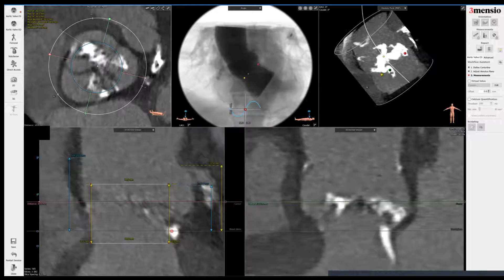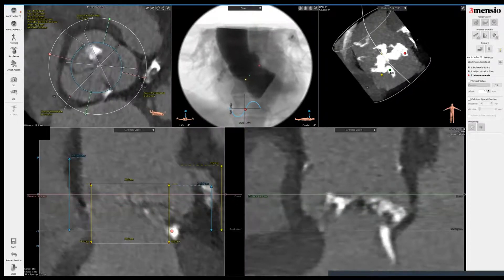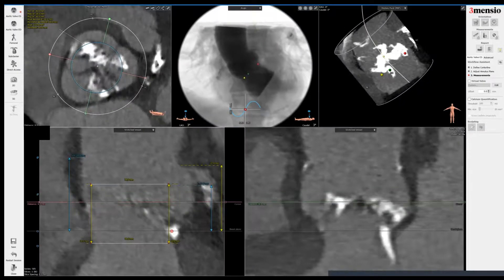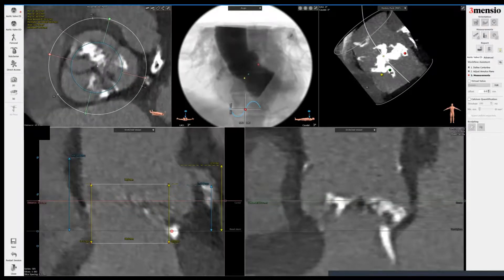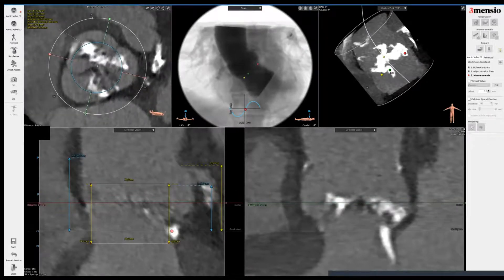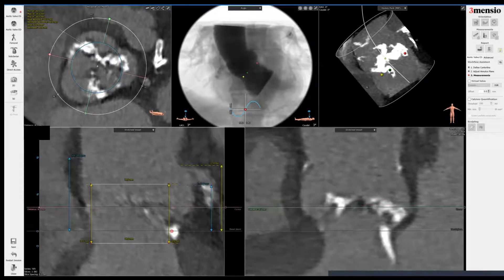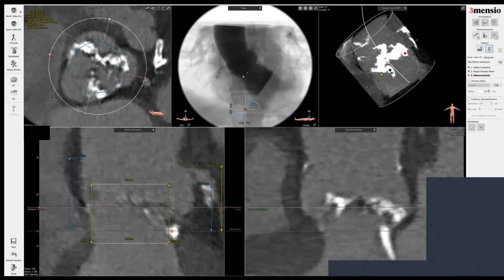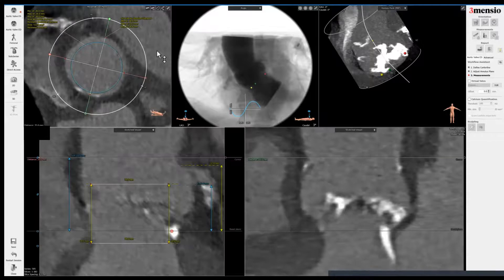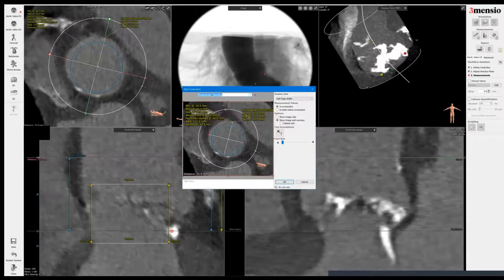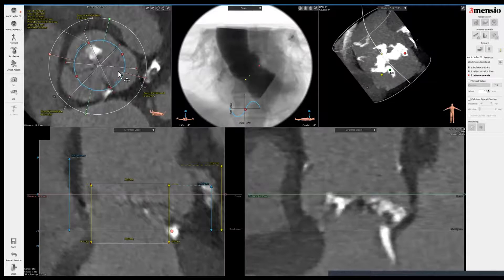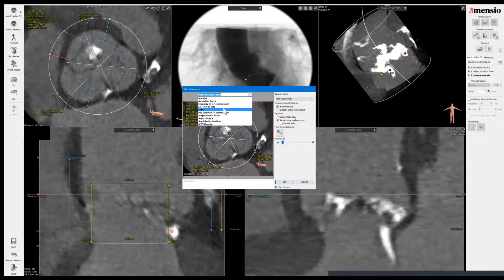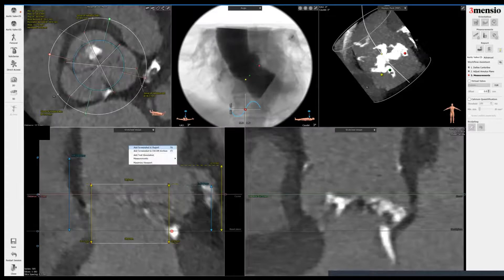Some people ask whether you do supra-annular sizing. I do not do that typically. What I do measure sometimes is if you have very asymmetric sinuses — this patient has relatively symmetric sinuses — you can consider a commissure-to-commissure distance to see how the valve will fit, but it has not really affected my sizing strategy per se. I still prefer to size at the level of the annulus. Next I go to the sinus tubular junction and save that image, then go to the sinus, center the circle, and save the image. I show the left main and save that image as well.